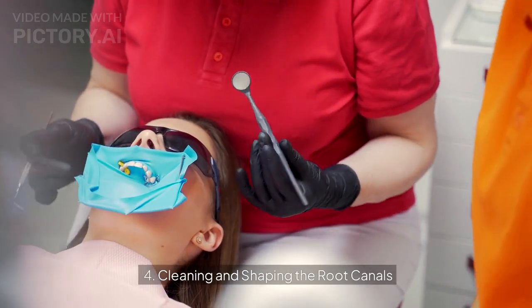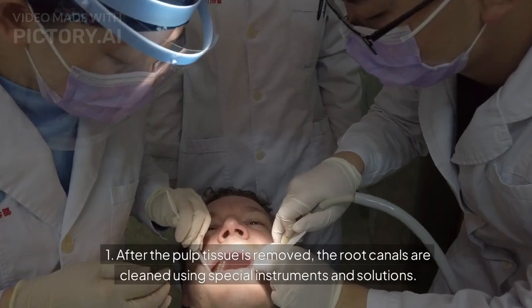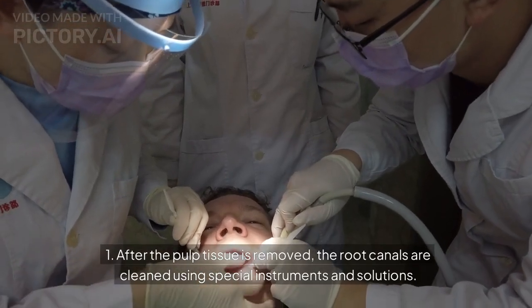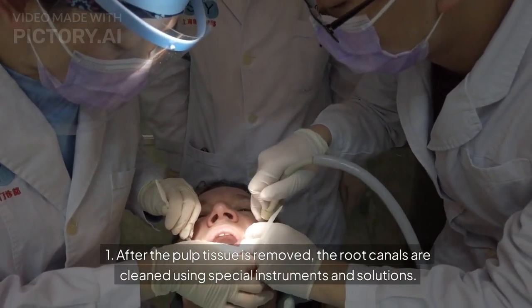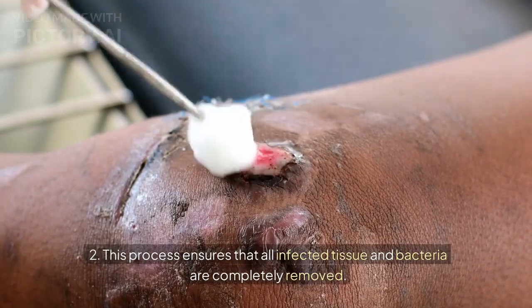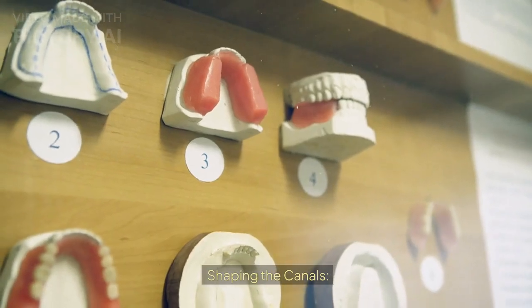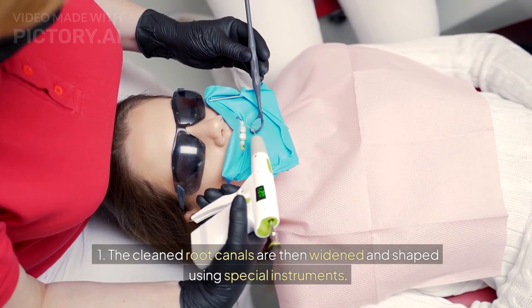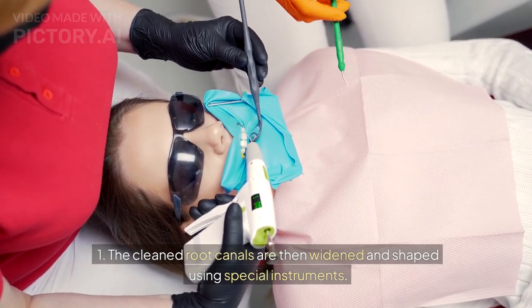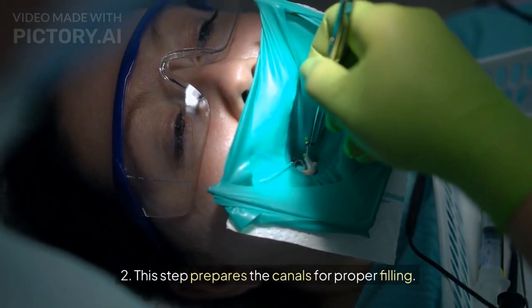4. Cleaning and shaping the root canals. Cleaning the root canals. After the pulp tissue is removed, the root canals are cleaned using special instruments and solutions. This process ensures that all infected tissue and bacteria are completely removed. Shaping the canals. The cleaned root canals are then widened and shaped using special instruments. This step prepares the canals for proper filling.